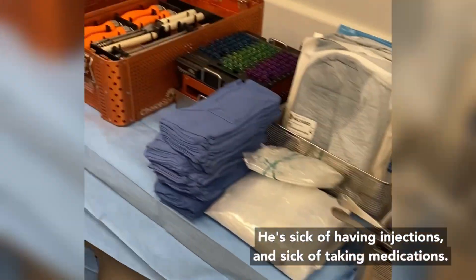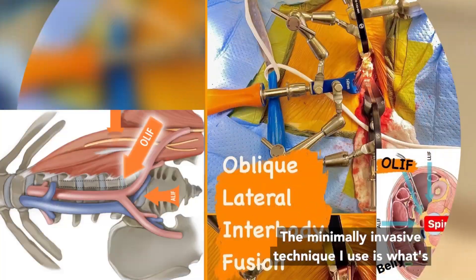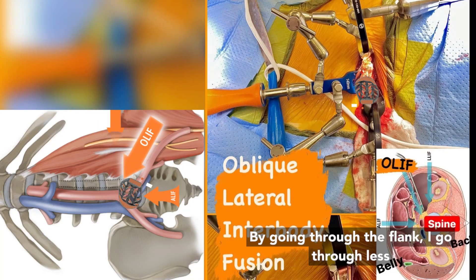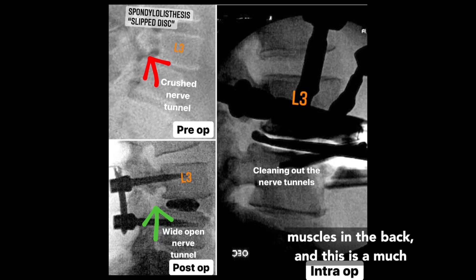He's sick of having injections and sick of taking medications. In the OR, we have all of our equipment from Camber Spine set up and ready to go. The minimally invasive technique I use is called an OLIF — you actually go through the patient's left flank to get to this disc space. By going through the flank, I go through so many less muscles than the back, and this is a much less painful surgery.